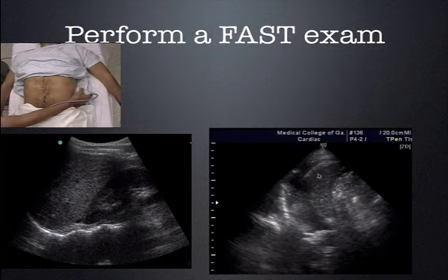Here's a positive finding. Here's the spleen, here's the diaphragm, here is free fluid in the diaphragm and the spleen. This would be a FAST positive case.